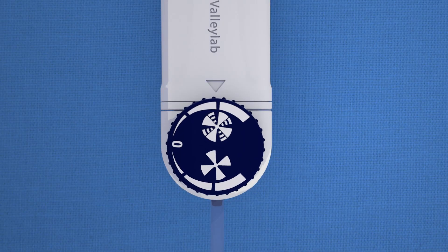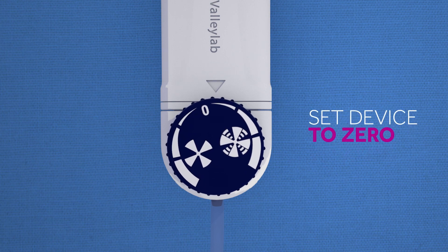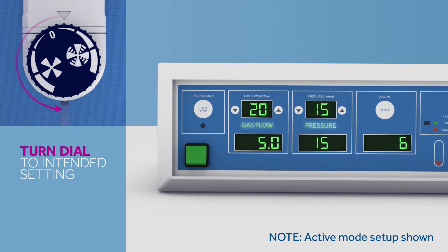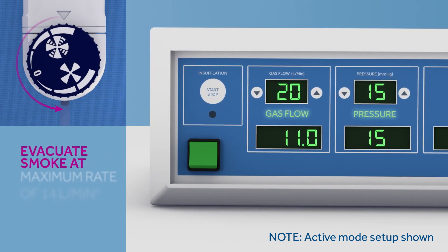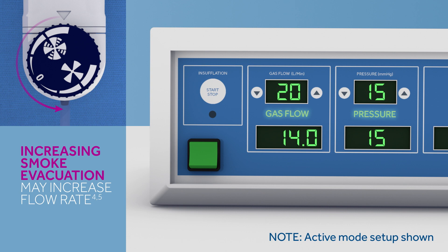To get an idea of how the device impacts gas flow levels on your insufflator, start with the device set to zero. Now turn the dial of the ValleyLab laparoscopic smoke evacuation system to your intended setting. The device is designed to evacuate smoke at a maximum rate of 14 liters per minute. As you increase the rate of smoke evacuation, you may notice the insufflator flow rate increasing — it is replacing the gas that is flowing out through the smoke evacuator while maintaining the set pressure. This is normal, and the system is designed to be used without the loss of pneumoperitoneum.